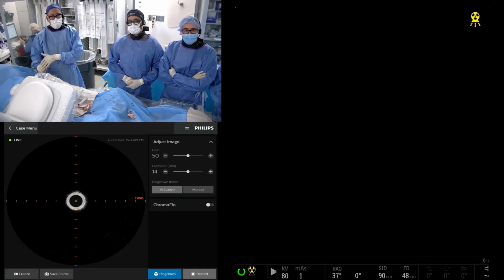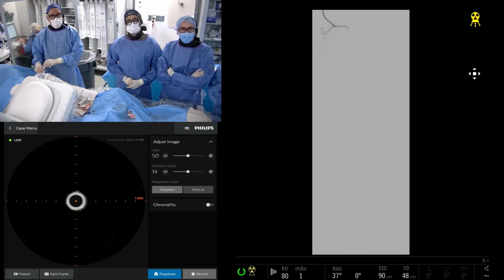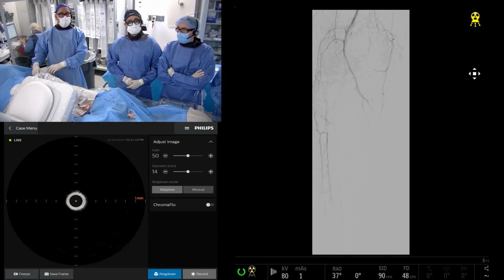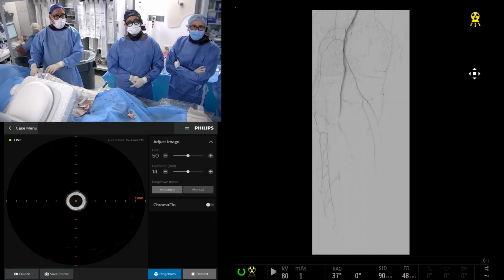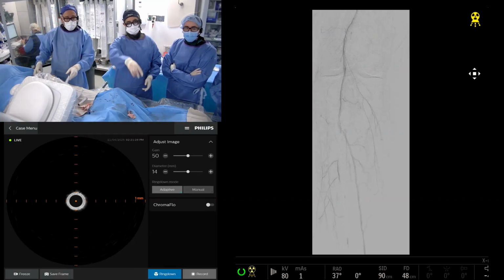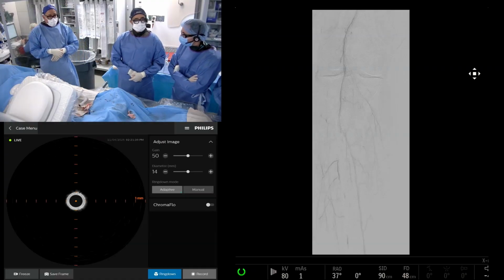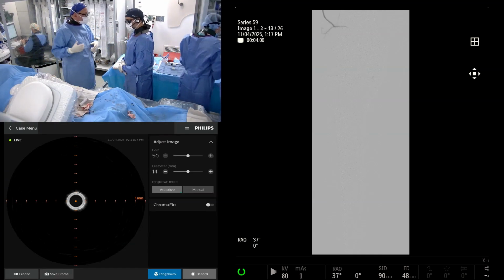Ready? And are we heparinized again? I gave him a bolus of heparin. Maybe it is thrombus. We also need to draw an ACT. The peroneal's trying to come back. Yeah, I have no interest in chasing it. I think it's a lot of recoil. I agree.